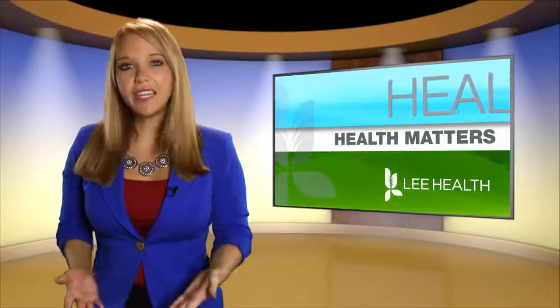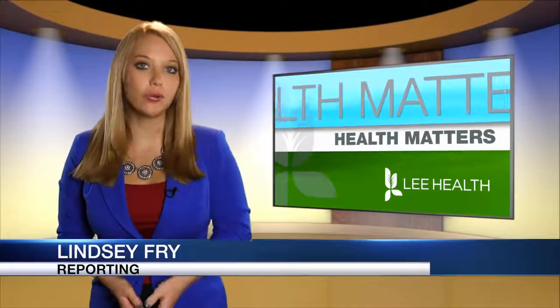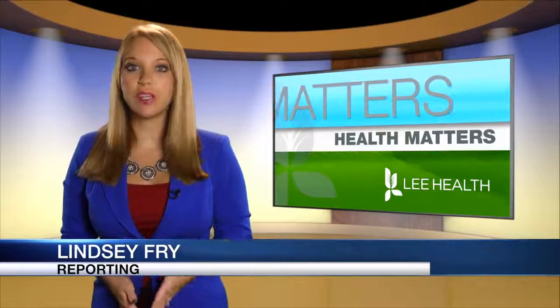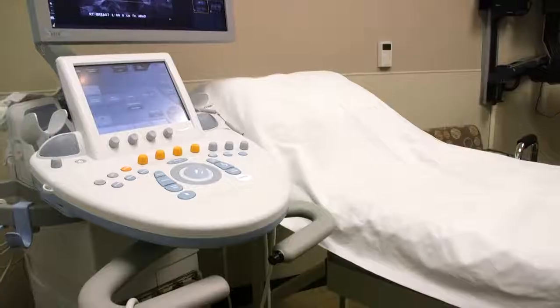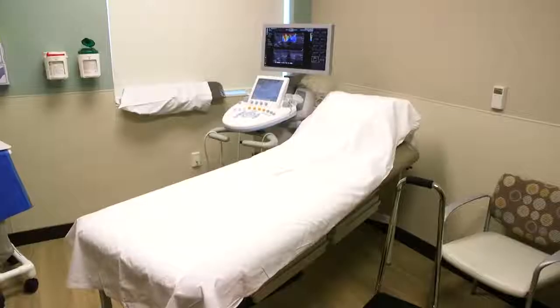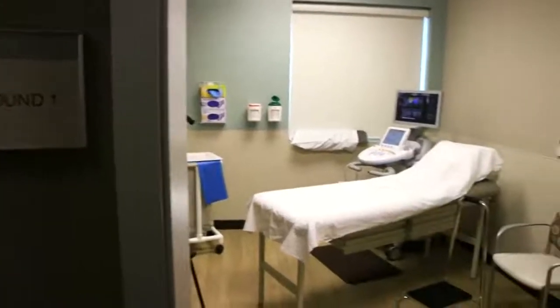If doctors find anything suspicious during a mammogram, they may call the patient back to get a breast ultrasound. There, a technician will use an ultrasound machine to get a closer look at the area of concern. It's usually a question-answering tool. So it's more of a problem-solving modality rather than a screening modality.